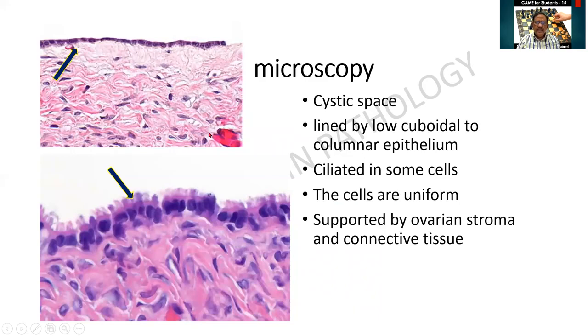They'll be focusing the slide and we are supposed to make a diagnosis. I'm finding a single layer of a low cuboidal epithelium that is lining. And the point exactly where I am pointing is the lumen of the cyst.